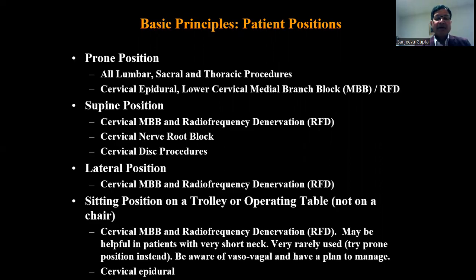So be aware that the sitting position is not ideal at all. If at all you're doing it, it has to be on a trolley or an operating table. Some colleagues, if they contemplate doing this procedure in the sitting position, routinely give some glycopyrrolate to prevent vasovagal episodes. Cervical medial branch block and RF can be done, and cervical epidural can be done. I have not used the sitting position for maybe 15 years or more. I can easily do procedures in prone or lateral position.